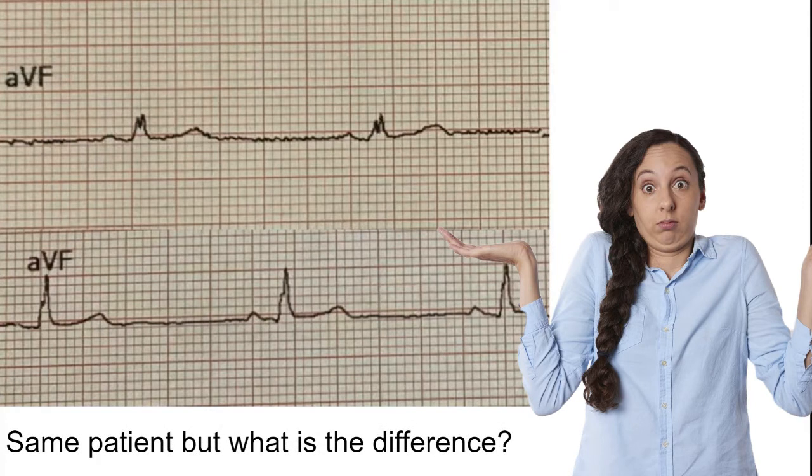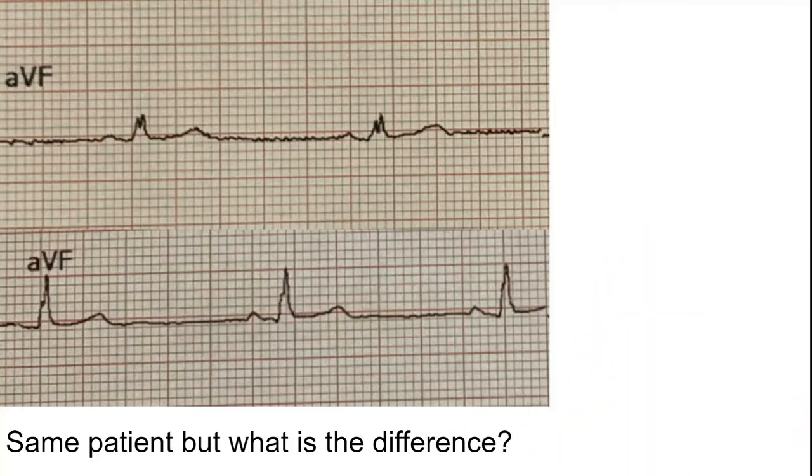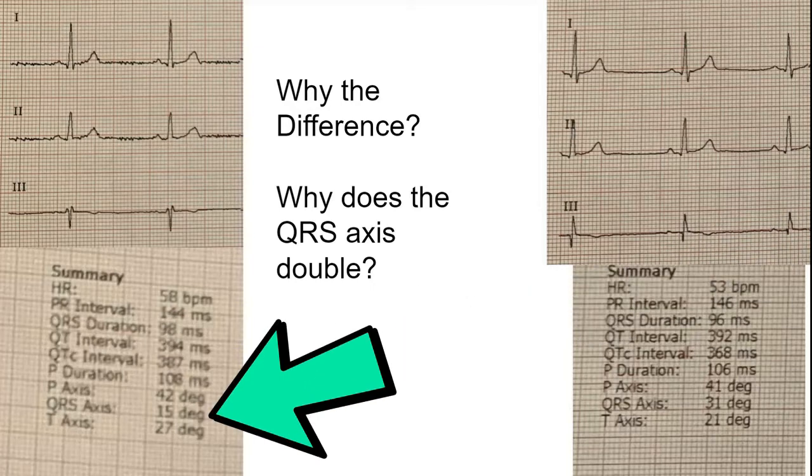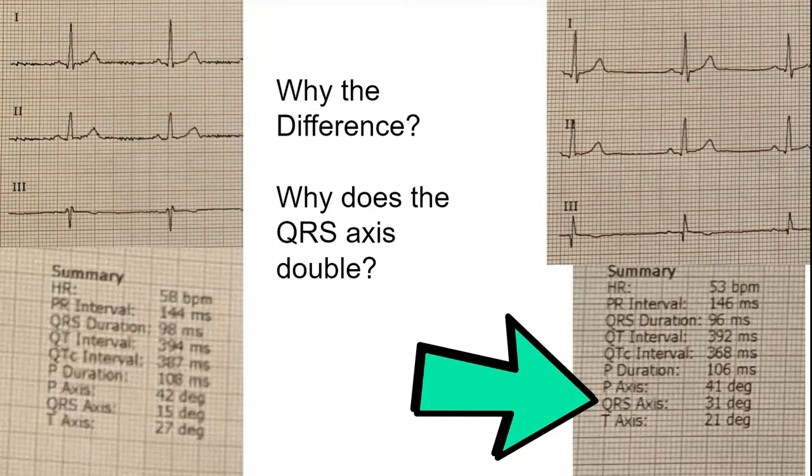Here is AVF and AVF. And once again, same patient, same time, same place, same day. And why do these look vastly different? Why do we see a major difference here? Why do we go with our axis deviation of 15 degrees to 31 degrees? And why do these leads look different?